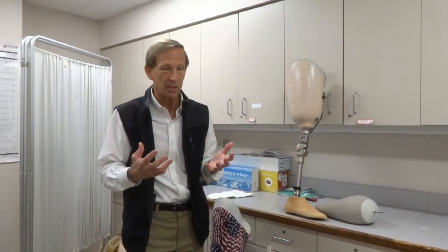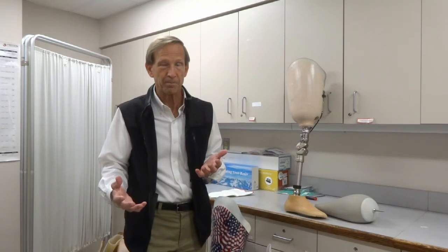Hopefully that answers some of your questions about socket design for above-the-knee amputees. Realistically, these are much more challenging than amputation below the knee. Good luck, and thanks for listening again.